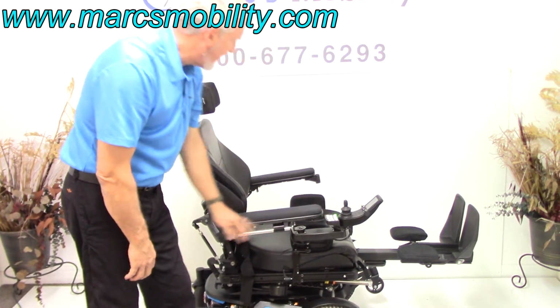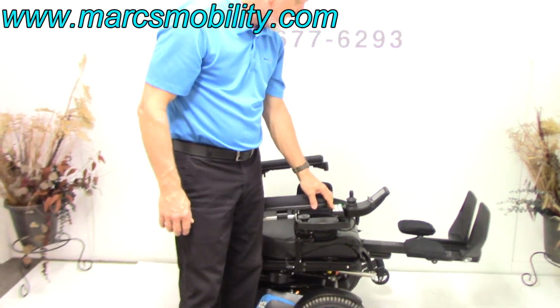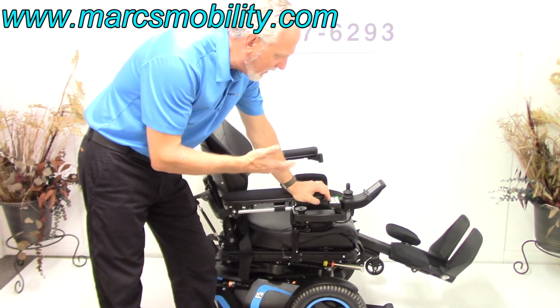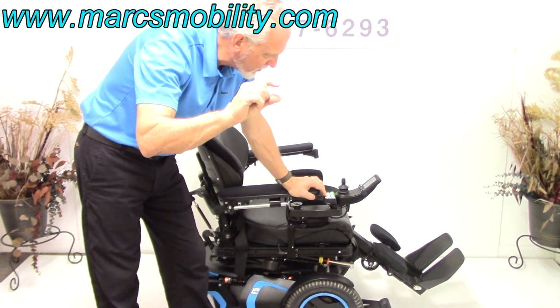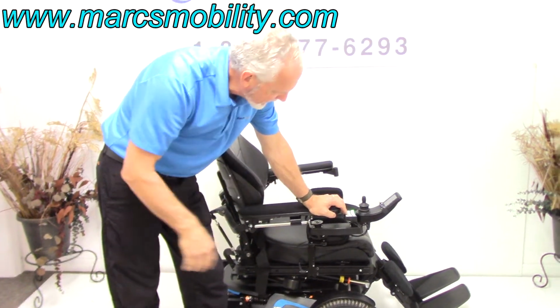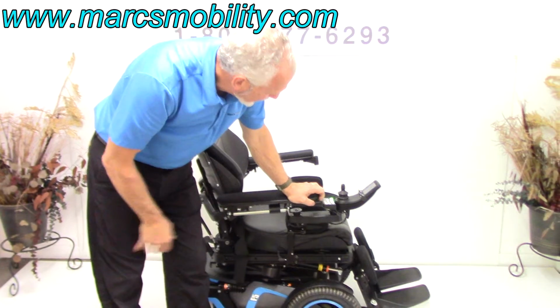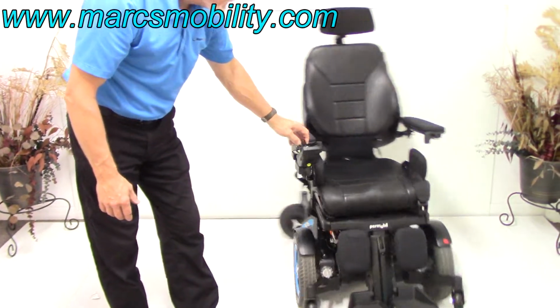So I've got the recline back up. I'm going to bring the legs back down now. When you're outside, make sure your legs are always out, because if you have them right under the chair, you're not going to have much space under your electric legs, and I would hate for you to hit a crack in the sidewalk and break something. And these are already close to the ground already. So leave them out like that. That gives you a little more clearance.